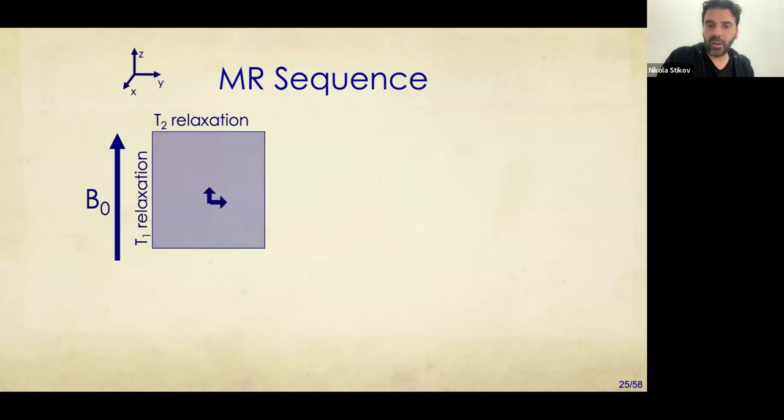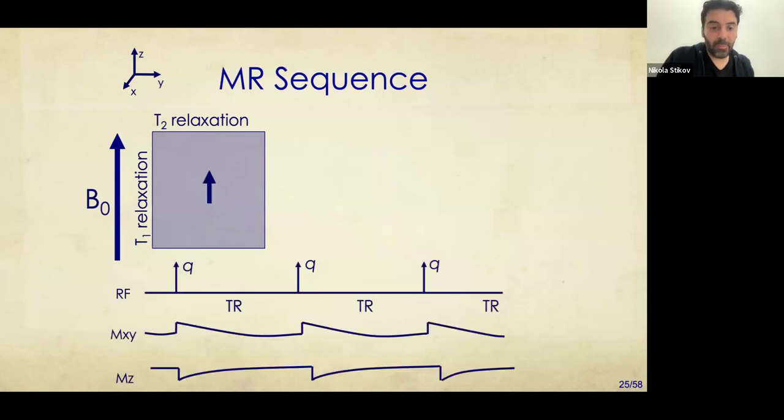And if you repeat this long enough, that is actually the basis of something called an RF pulse sequence. So these MRI pulse sequences are protocols that you apply so that you're able to generate a good image of your body. What do you do? You excite, and then you let the magnetization recover and relax.